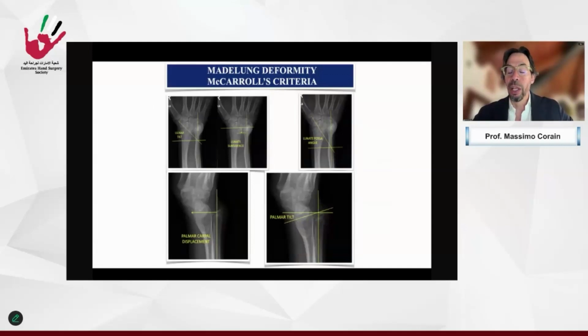I saw that it was useful above all in Madelung deformity, because Madelung deformity is not easy to understand and to see in the best way. There are the McCarroll criteria in Madelung deformity that help us to understand the ulnar tilt, the lunate subsidence, the lunate fossa angle, the palmar carpal displacement, and palmar tilt.